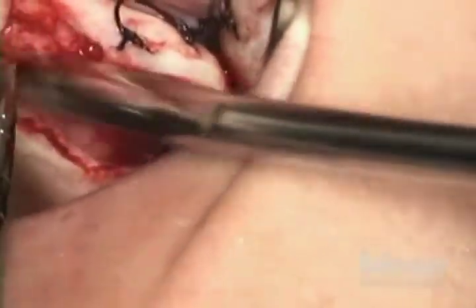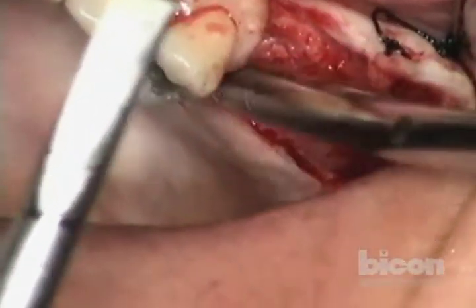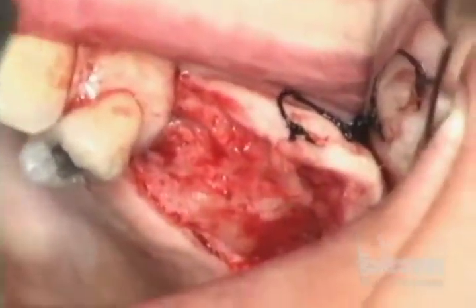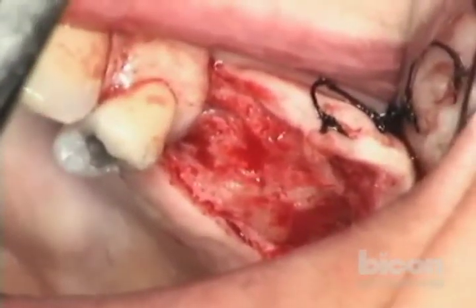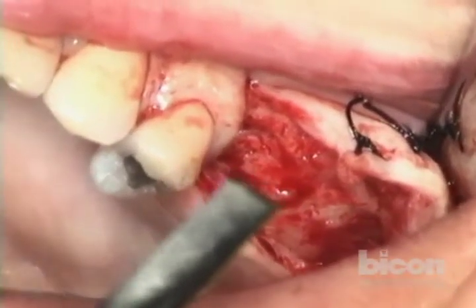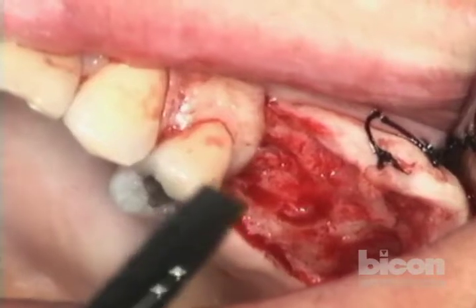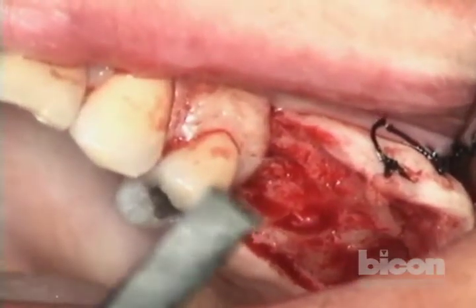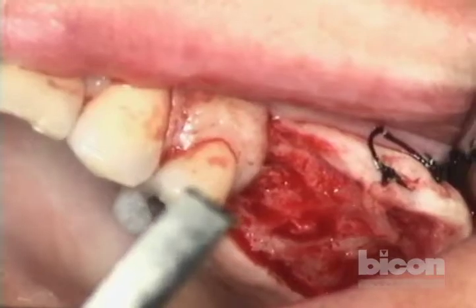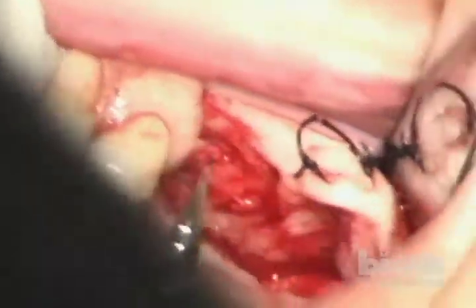Now in order to do this, we will start with the mesial cut. This is an osteotome that's five millimeters wide. I make the shorter cuts with this one and then make the longer ones inside these two, so I know the width of my rectangle is not going to be more than five millimeters.